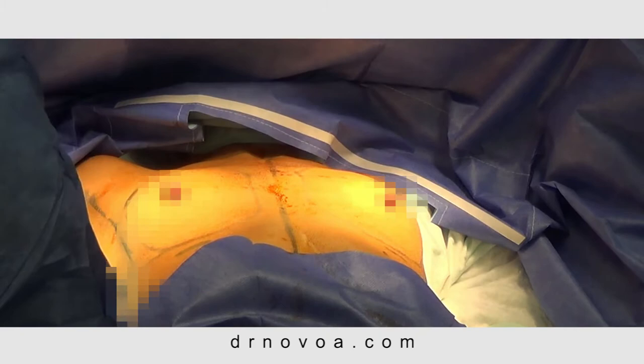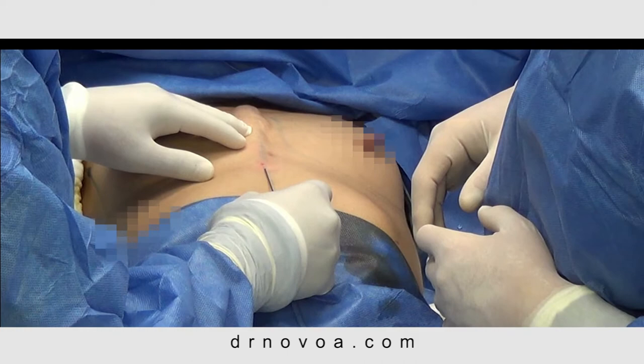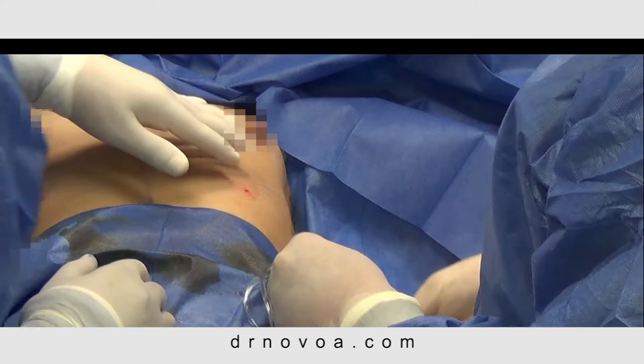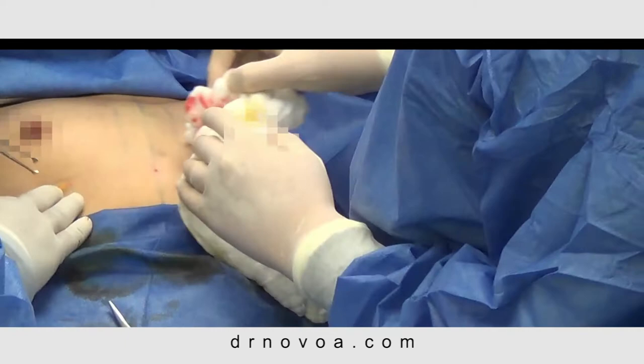Surgery begins with infiltration of area 1, the mid-sternal line, from the xiphoid process to the second rib, moving on to area 2 of each breast, along the inframammary crease, up to the nipple areolar complex. Then area 3, 4, and 5, infiltrating tumescent lidocaine in the space created between the pectoralis muscles and the intercostals on each side. The initial incision is made in the inframammary crease.